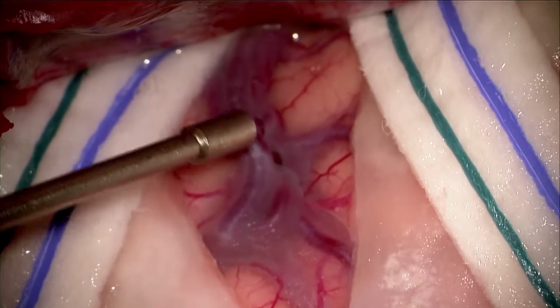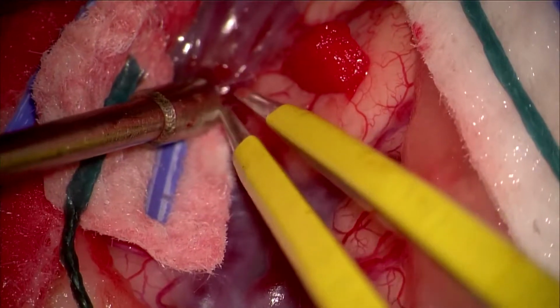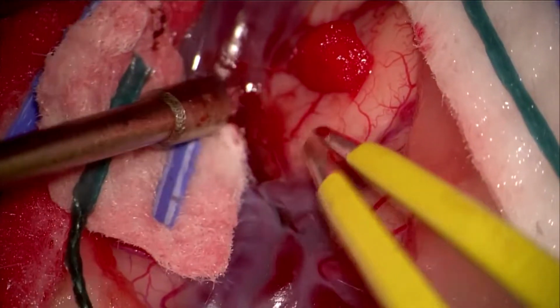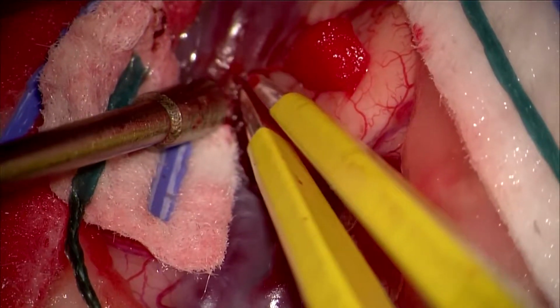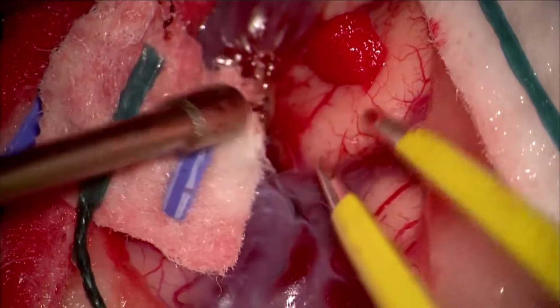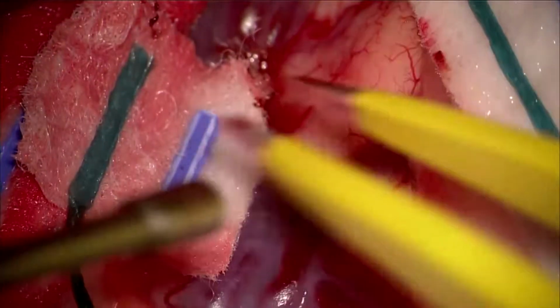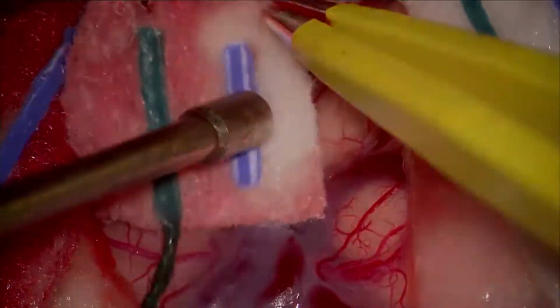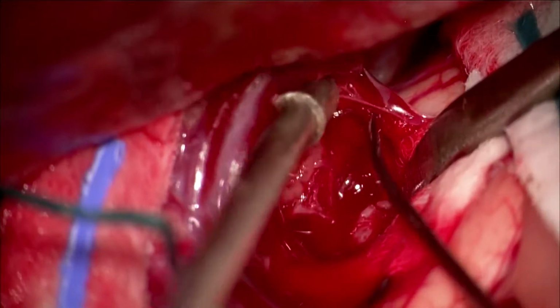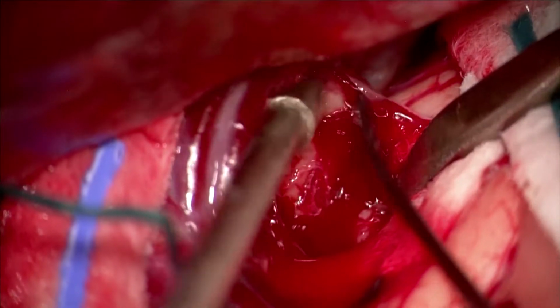As you can see, there are large veins, and by using instruments and separating those veins from the surrounding brain, I'm able to open this, which will allow access to where the aneurysm is. Periodically, you do have some small bleeding from these small vessels, and treatment with cautery, which was done there, is typically preferred if possible. Further dissection a little bit deeper into the sylvian fissure itself.